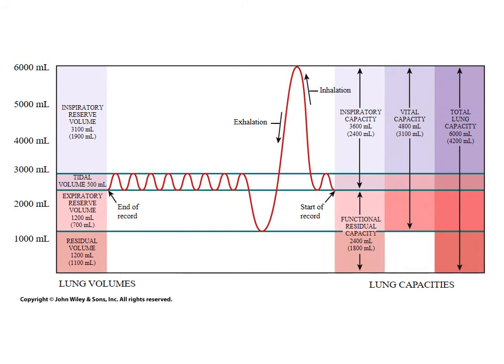Now, what I want you to understand is, and I'm going to try and highlight this little bar right here, the bottom part of a tidal volume is a dividing line in the lung. One respiratory cycle is simply the breathing in and then breathing out. Once I stop and start to breathe back up, I'm starting a new respiratory cycle.